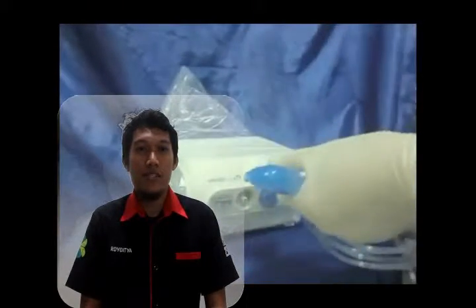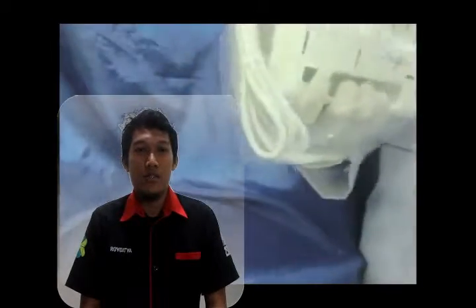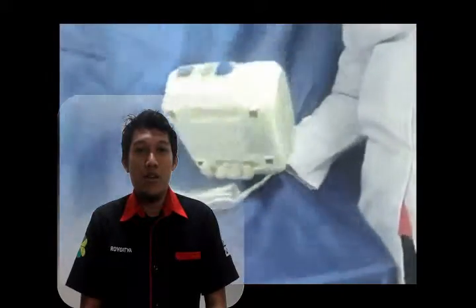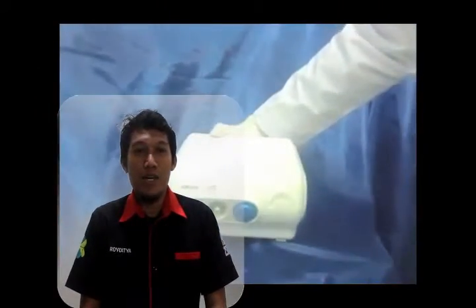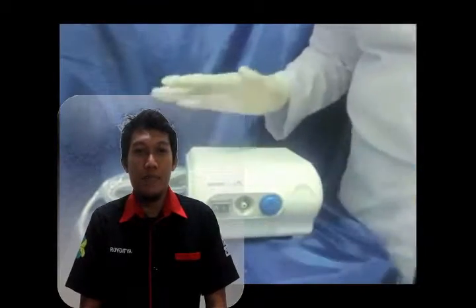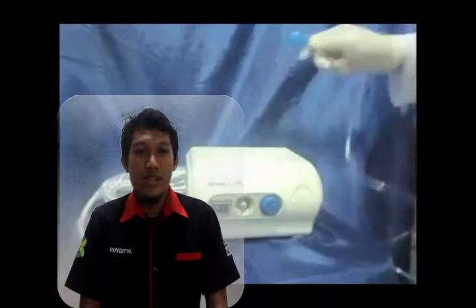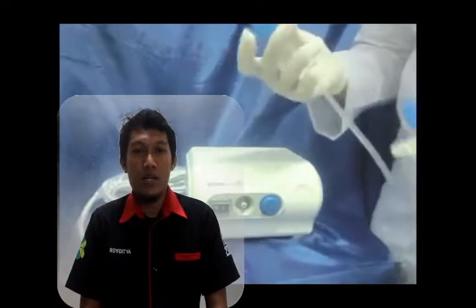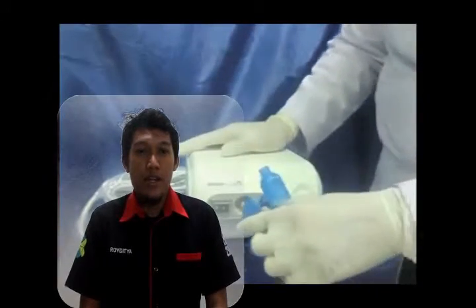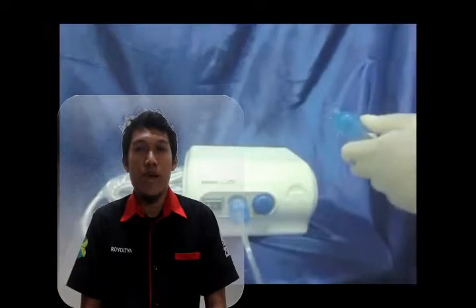Three, replace nebulizer parts by following the manufacturer's replacement schedule. Four, keep your nebulizer free from dust that can clog the compressor. This can be done by wiping the machine down daily with a damp cloth or keeping it in a dust-free environment like a drawer or cloth bag.